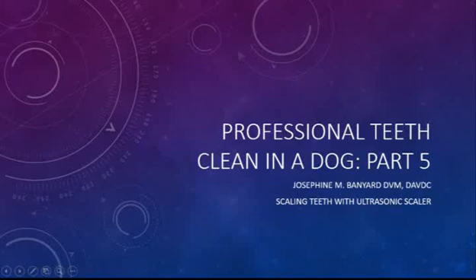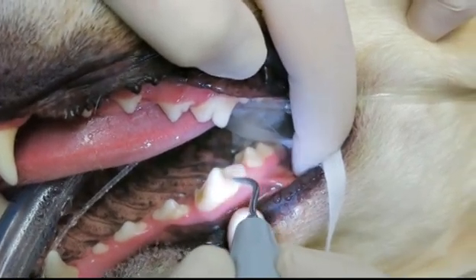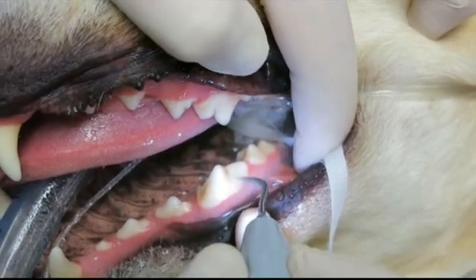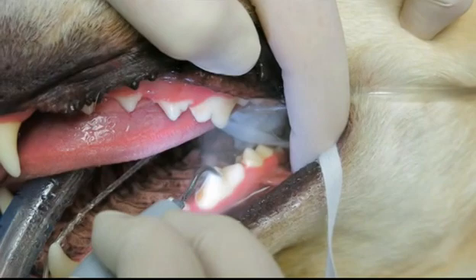Hi, I'm pet dentist Jo Banyard, and in this video I will scale my patient's teeth with an ultrasonic scaler. Don't want to be on each tooth for too long — don't want to heat it up — but there's cold water coming out, cooling down the tooth and the instrument.